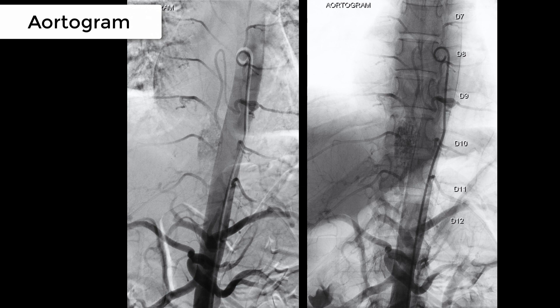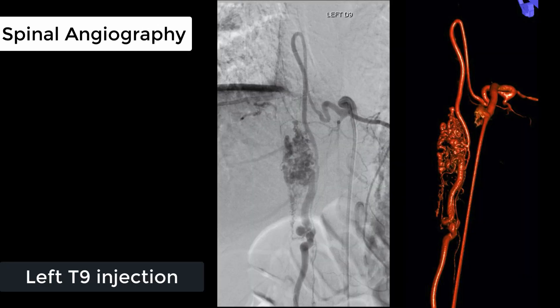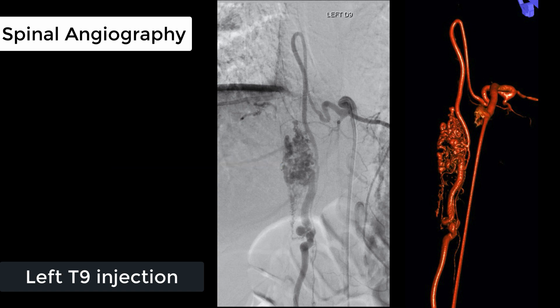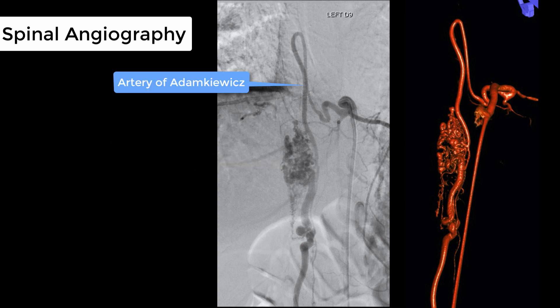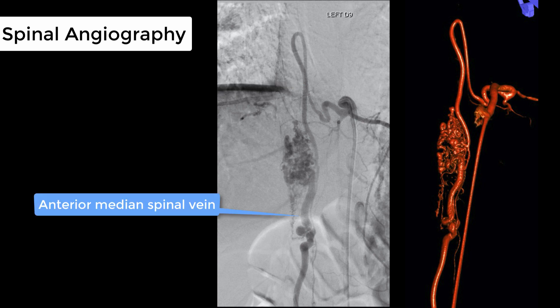Initial angiogram showed AVM nidus feeding from the artery of Adamkiewicz, which is arising from the left T9 intercostal artery. Selective left T9 intercostal injection showed a high-flow AVM nidus feeding from a hypertrophic artery of Adamkiewicz, and the AVM nidus is draining via a dilated tortuous anterior median spinal vein.